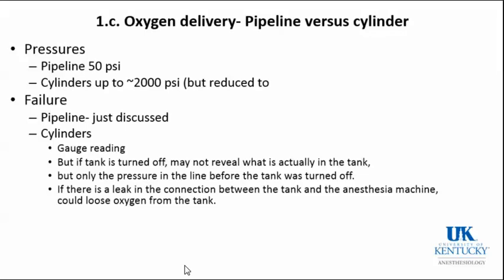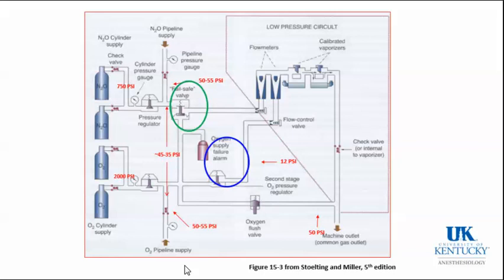However, remember that when the tank is turned off, the pressure that's being measured is right in here, which is trapped between the tank and the pressure regulator.